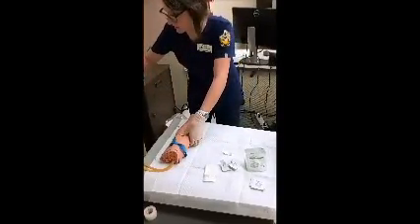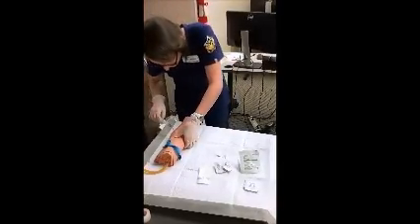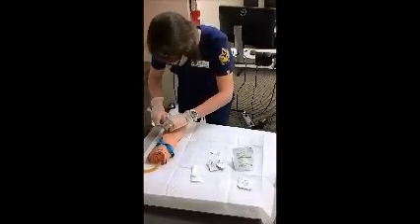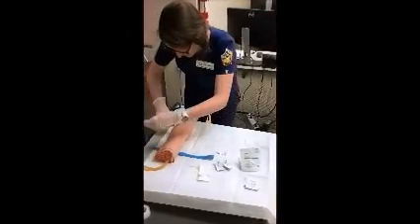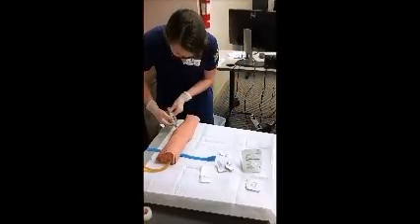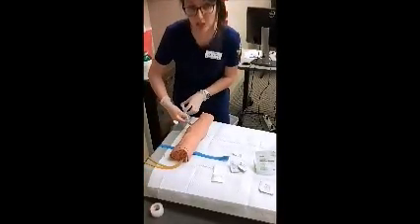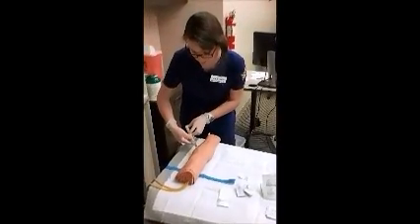We already primed, but it looks like we got some air in there, so we'll go ahead and push all the air out. And we're going to go ahead and attach this on. There we are. And we can pop the tourniquet now too. So now we'll withdraw to make sure that we're actually getting blood into the saline IV push, so we can make sure we're actually injecting into a vein and not into soft tissue, which would cause infiltration.